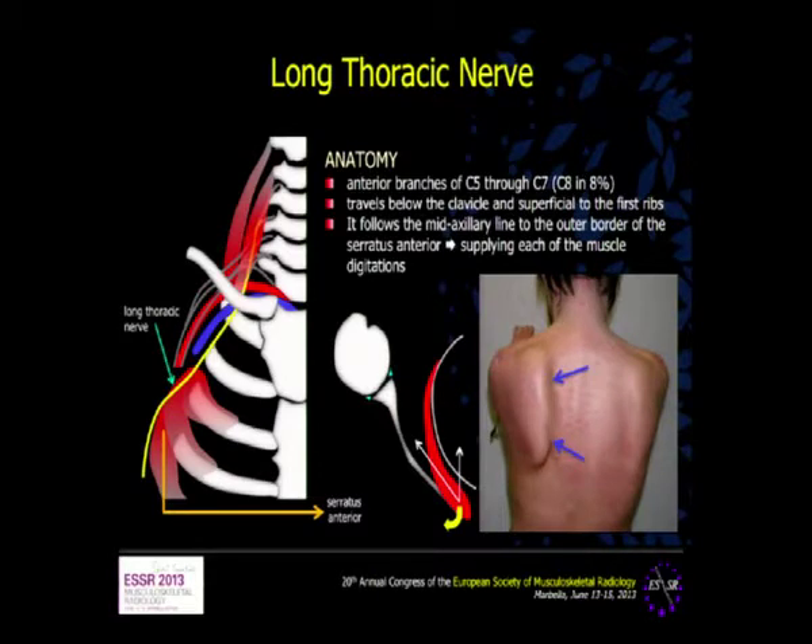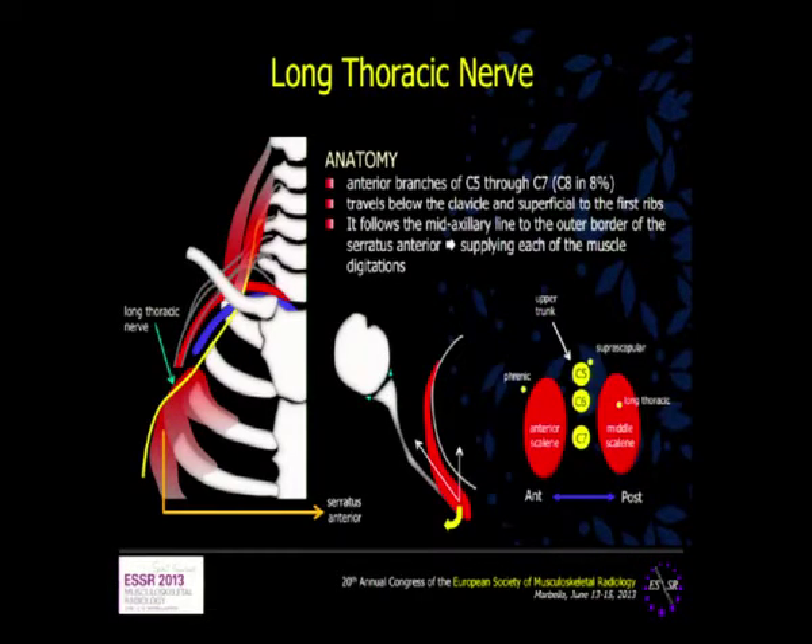This is the function of the serratus anterior. In cases of a palsy of the long thoracic nerve, we have the characteristic winging scapula. When we check the scalene muscle on the transverse plane — remember this scanning plane was also used for the suprascapular nerve — the position of the phrenic and the position of the long thoracic become clear if you know this arrangement.